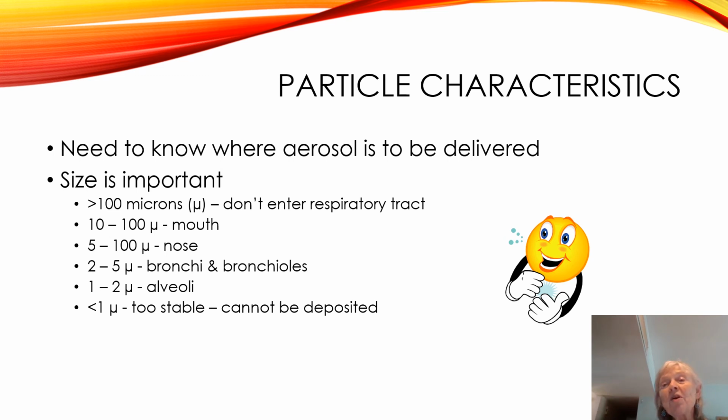Remember, particles are in constant, random motion. Although we have them in the airway, they continue to move and run into each other and will not settle out. When we talk about how we teach patients to breathe so that they can get the most of their medication, we're going to talk about a breath hold.